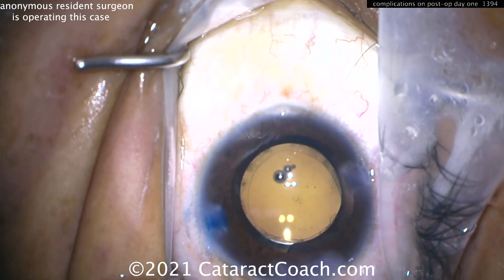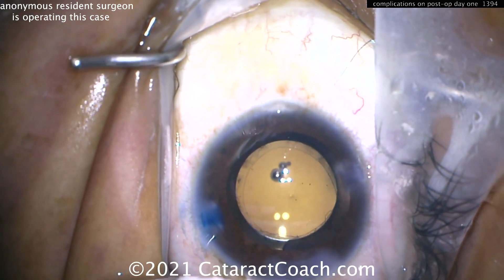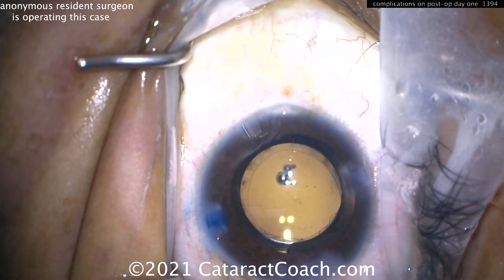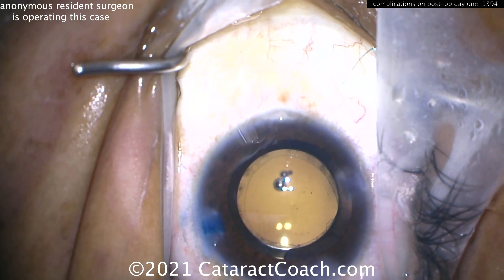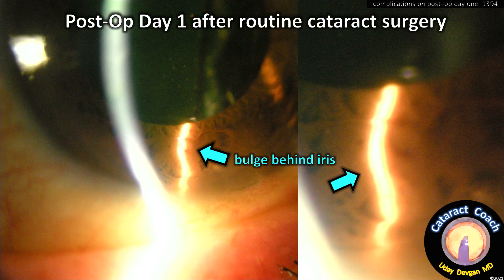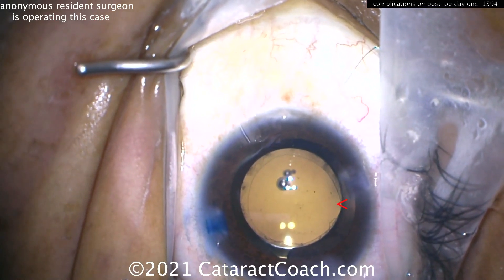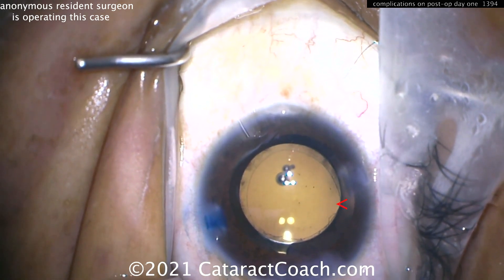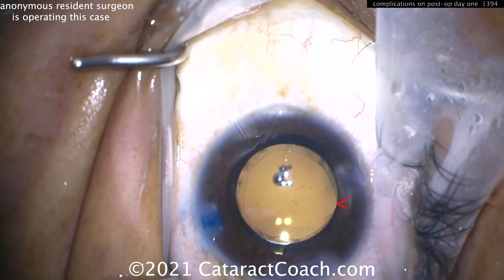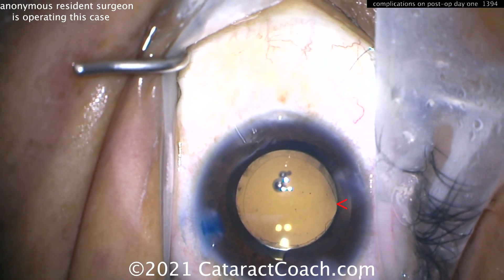In the subincisional area, the capsular rhexis is under the IOL. The temporal, subincisional haptic is in the sulcus, while the nasal haptic is in the capsular bag. This is not something you can leave. The resident doesn't realize it at all and may think it looks fine, but look carefully — the rhexis to the right of the incision is going underneath the IOL optic. This lens is effectively half in the bag and half in the sulcus.